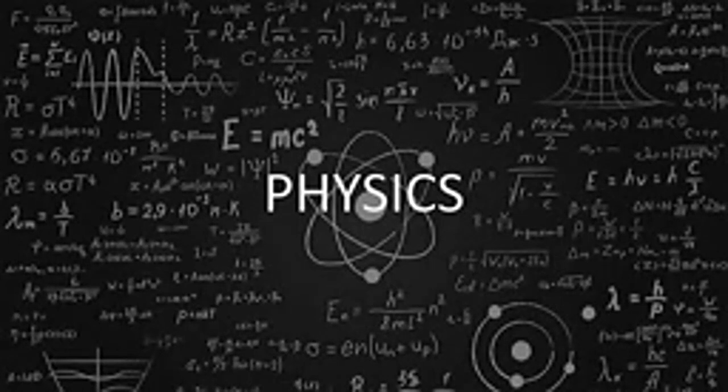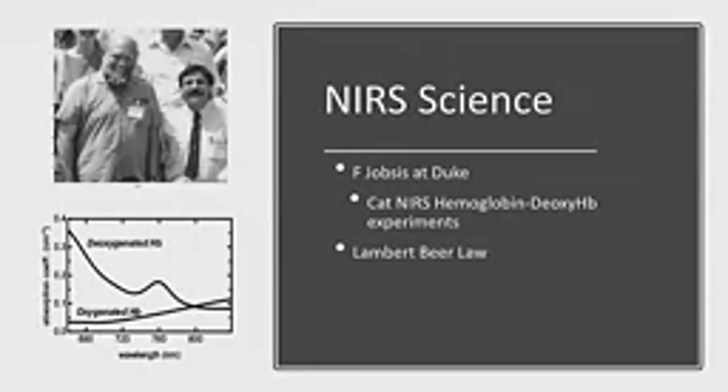Yes, I love mathematics and physics, but I'm going to give you really what I think is the basis of near-infrared spectroscopy, or NIRS. In the upper left, this is Franz Jobsis. He was a Duke scientist. He published in the journal Science using cat experiments. We've all done this before where we shine a light under our head and we see photons permeate tissues.